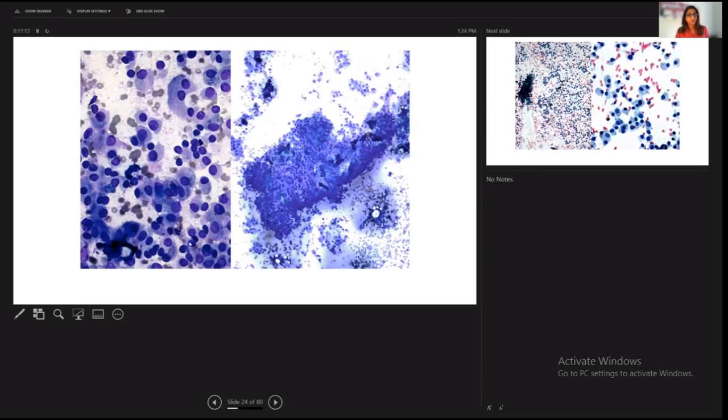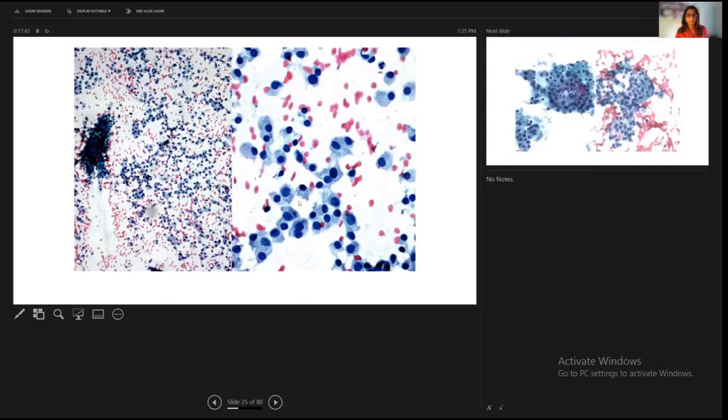And you can see this is the nodule here, a picture of this nodule showing predominantly oncocytic cells or Hürthle cells. Again, the Bethesda system wants you to use the term oncocytic rather than Hürthle. So we will refer to this as oncocytic cells. Oncocytic cytoplasm, fairly round nuclei, and slightly enlarged compared to that of the red blood cells. You can see the enlargement of this nucleus. And there is a nice vascularity running through these large clusters.